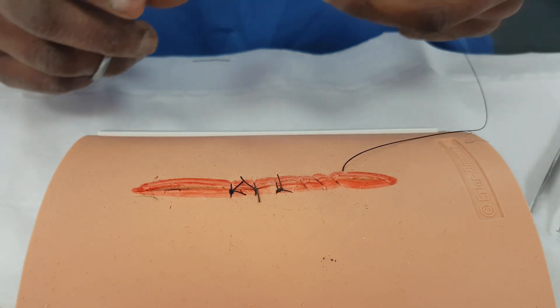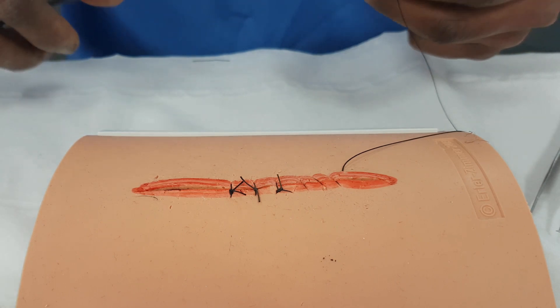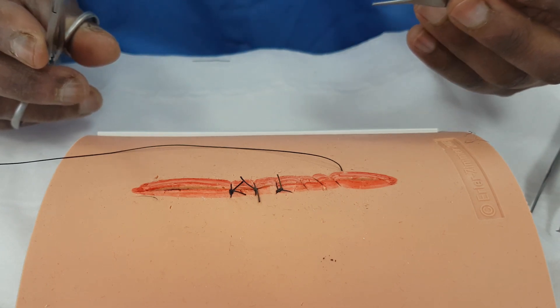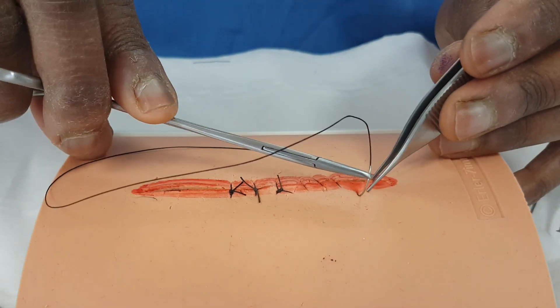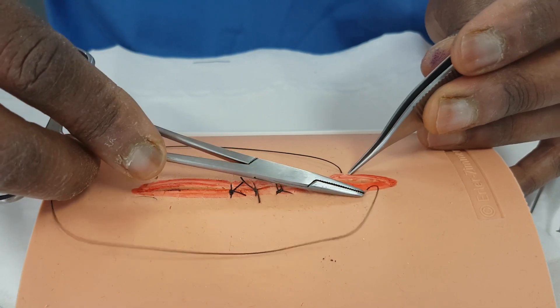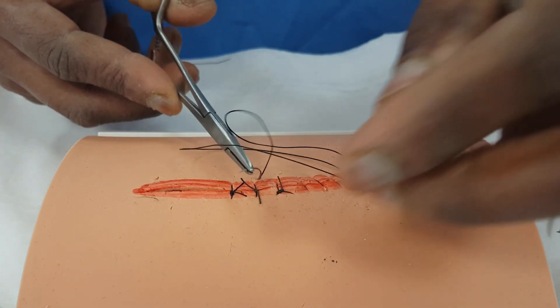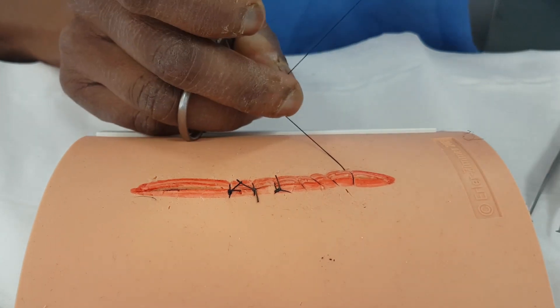What we could now do is something called a mattress stitch. Before we do that, have a look at this. This is where we want to get some really good haemostasis in the wound, where we want to make sure that we get an edge that isn't going to bleed. And we can do a stitch that's called an interlocking continuous. It's quite a funky stitch. You bring this through, and instead of just pulling it all the way through, you can go round through here, and as you pull, that will lock.